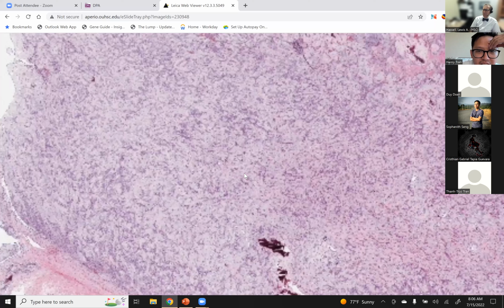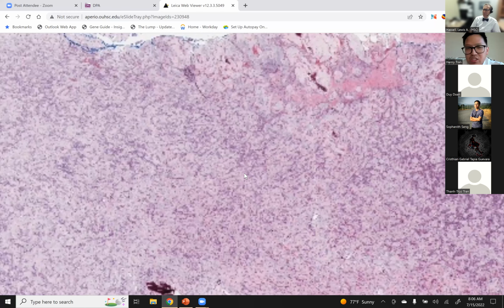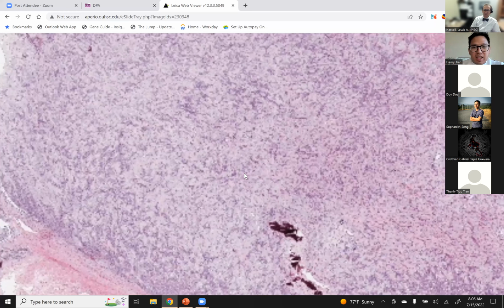I think if you get a chance to look at this on your own, at an intermediate power, you will see a little bit of an HPC, hemangiopericytoma-like pattern in the background. And it does also have actual Homer-Wright rosette-like differentiation as well. But unlike the other one, this one has the HPC pattern. But maybe this could be a weird mesenchymal chondrosarcoma, who knows?